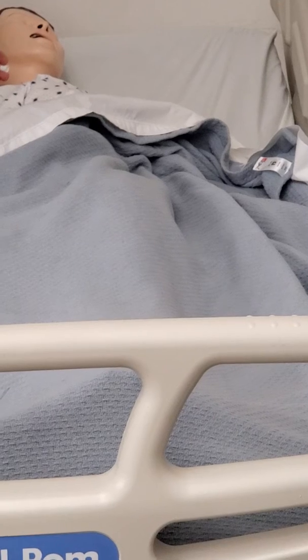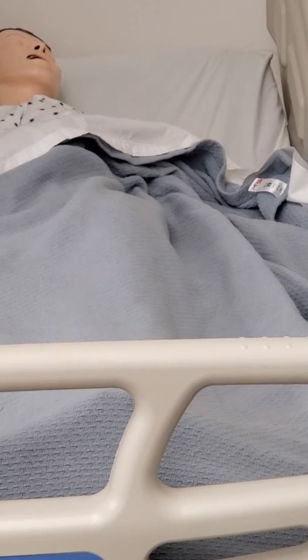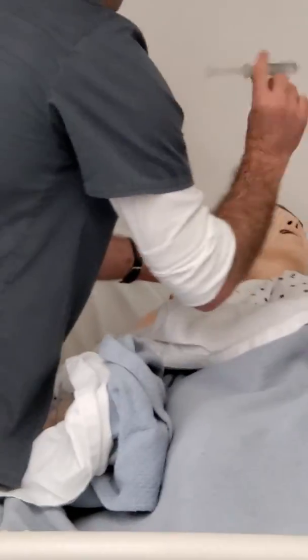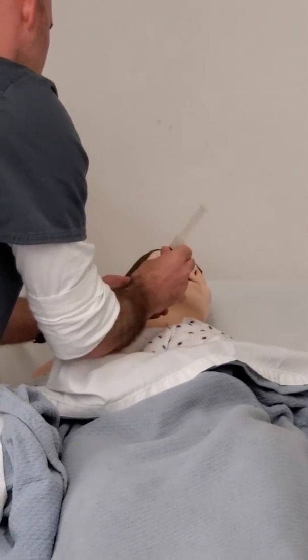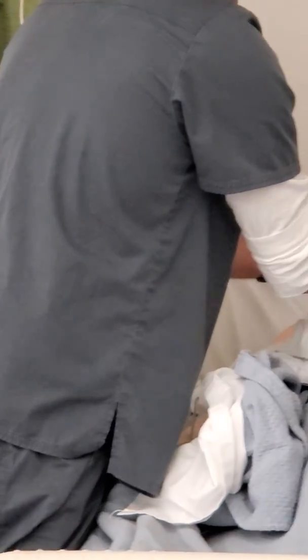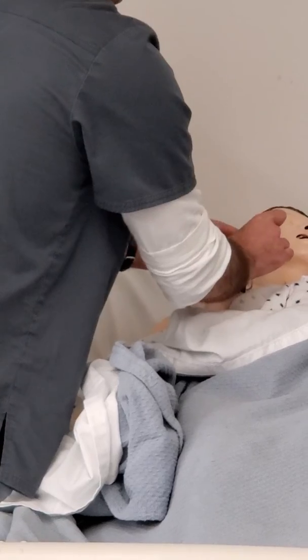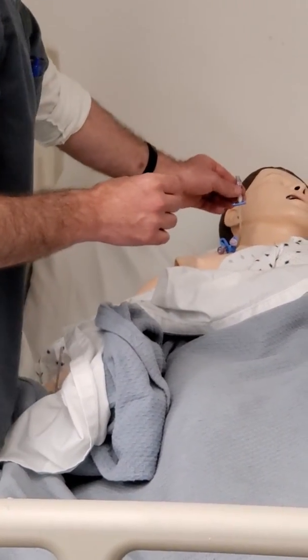Is it okay if a little bit of that drips out? Oh, yeah. That's all right, fine. You now wanna make sure there's no air in there. You don't wanna be injecting air right into the central line. I do not. No. So once I have that and I have the air out, it's gonna be down 2 minutes. It'll be in normal one, I think, and then I'm gonna do. Can I have the syringe real quick? There you go. Because I wanna have you be able to do it, but you can't really put that in there.